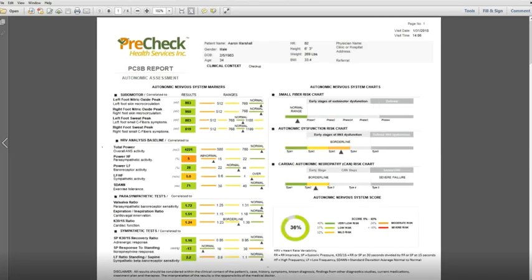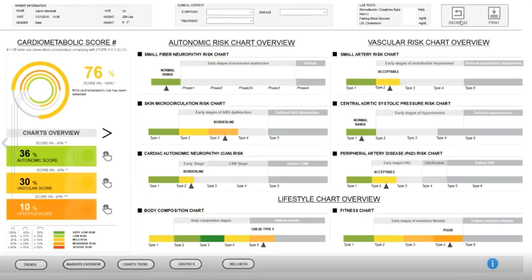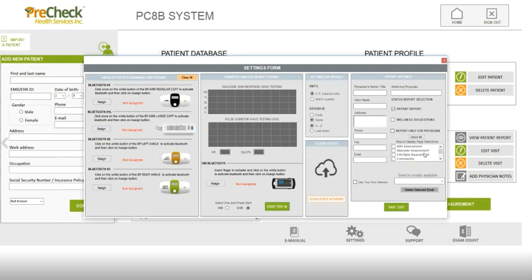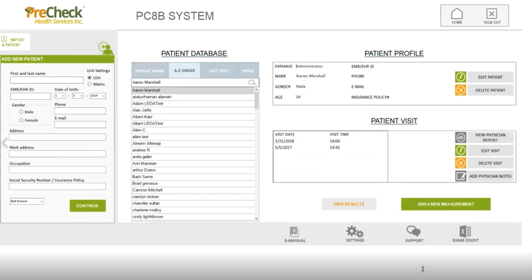and you should also, and I'm probably not defaulted to it, you can also select the overall score. So if you want to change the reports, you can. You go into settings. Okay, so I'm going to go ahead and select all. And I recommend the physician select all. You save and exit. And let's go ahead and view. So from this dashboard database, you can also manage the report. So we can view the physician report here.